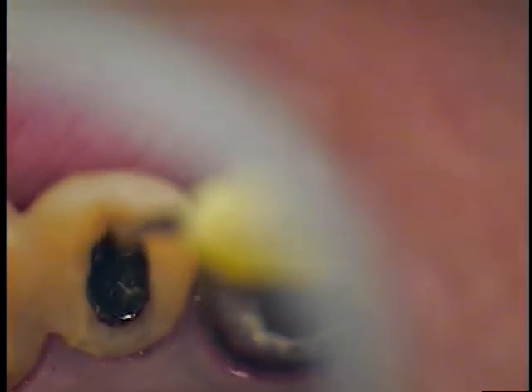So I saved this one, but now we've got to get our little new screw in there just temporarily. We're not going to over tighten anything, just enough. And we'll find our little abutment now. Here it is. Our new basal screw. There we go.